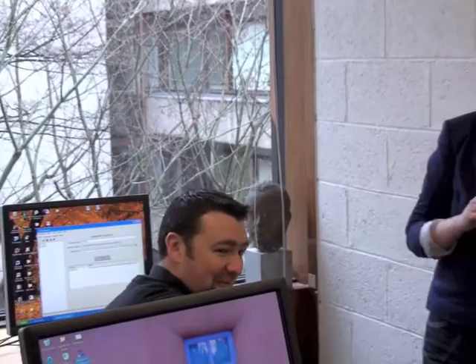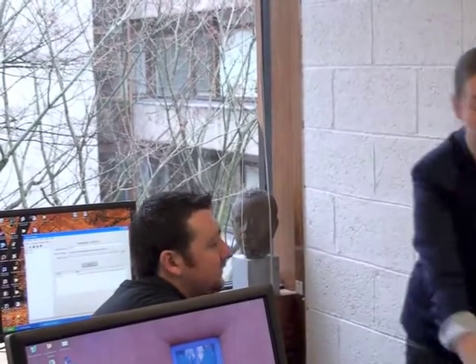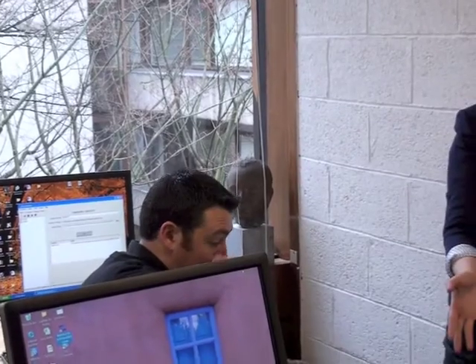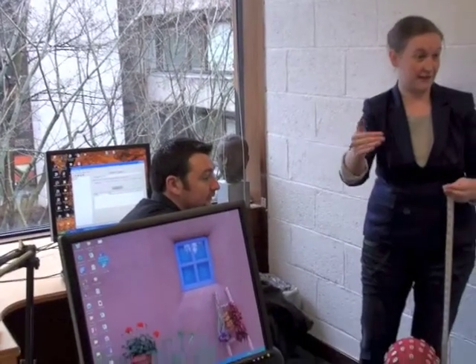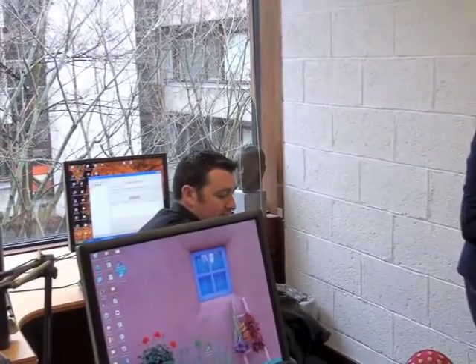No, that's fine. Your head is 61 centimeters, and on the website the advice is if your head is 50 to 54 or 54 to 58 centimeters, you use this cap. But I would always use it for above that. I wouldn't get the larger cap for that. It's not going to work well, in my experience anyway.